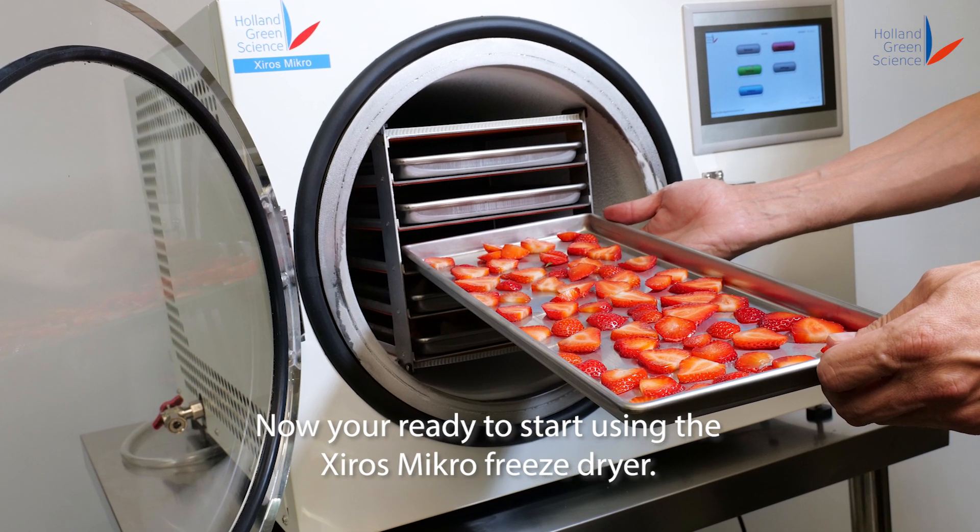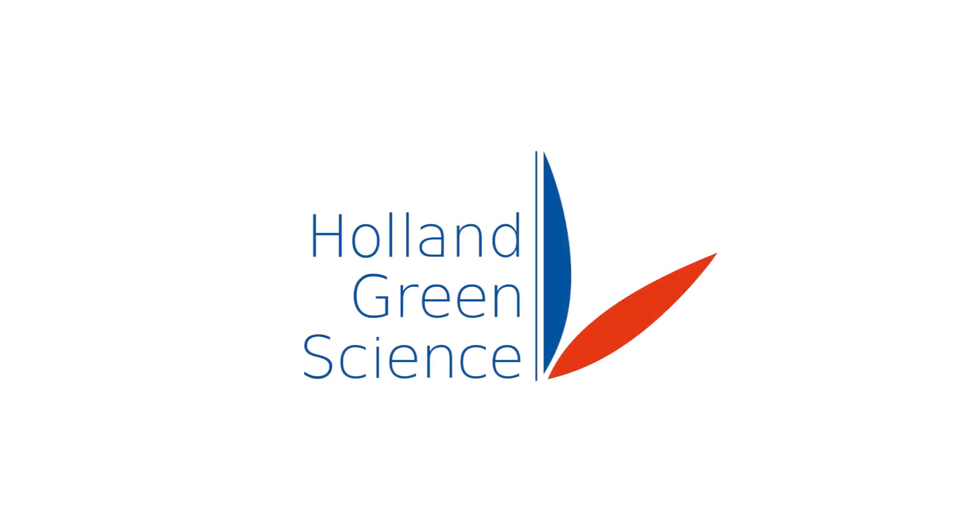Now you're ready to start using the Xiros Mikro Freeze Dryer.